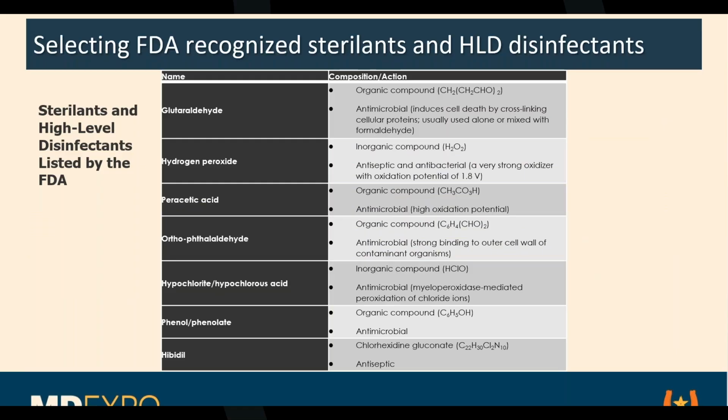And each one of those, so when the original equipment manufacturer of the probe is selecting materials that they're going to have for the housing, the cable, and the lens material on the front of the probe, they have to take into consideration and validate whether they are going to be able to survive in this chemical environment with the printed instructions for use from the chemical manufacturer.